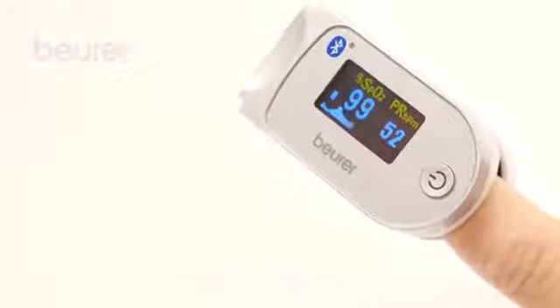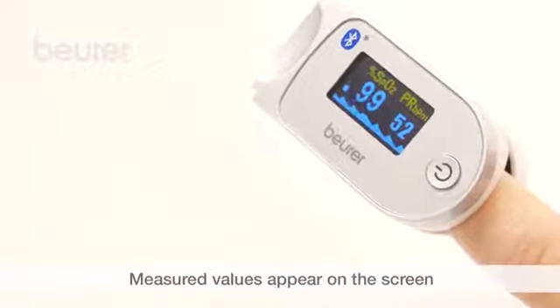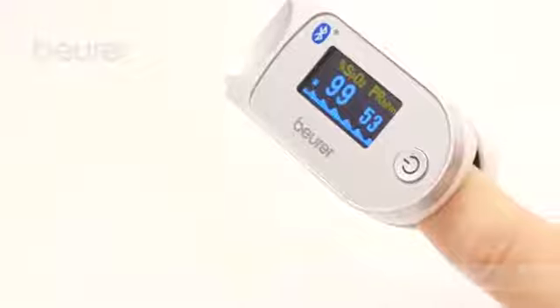The measured values will appear on the Pulse Oximeter display after a few seconds: Oxygen Saturation, Pulse Frequency, Pulse Wave, and Pulse Bar.